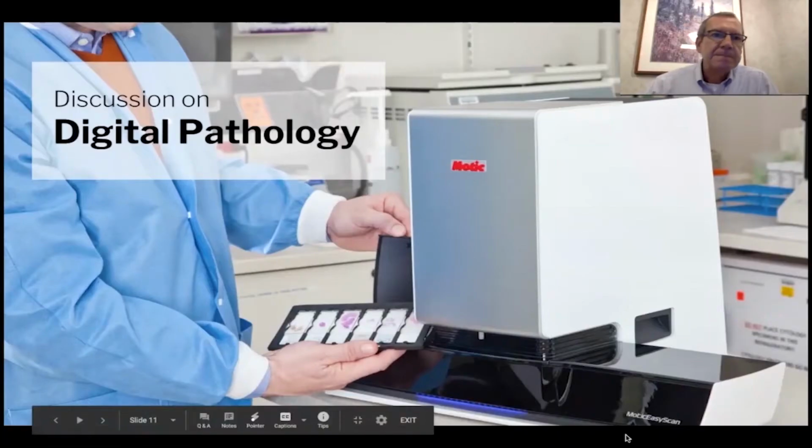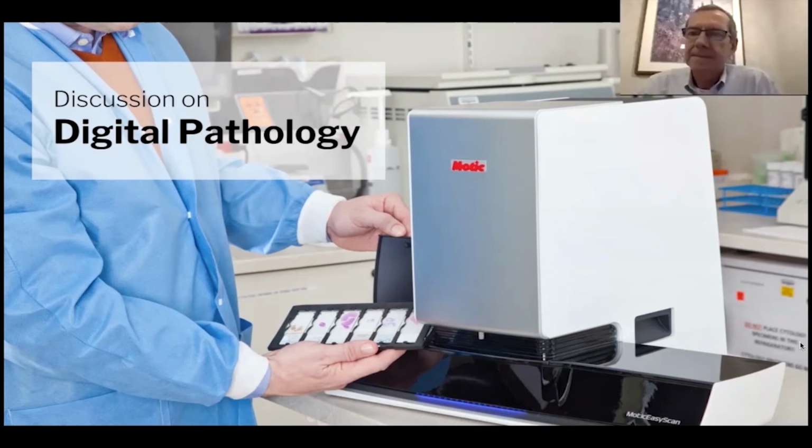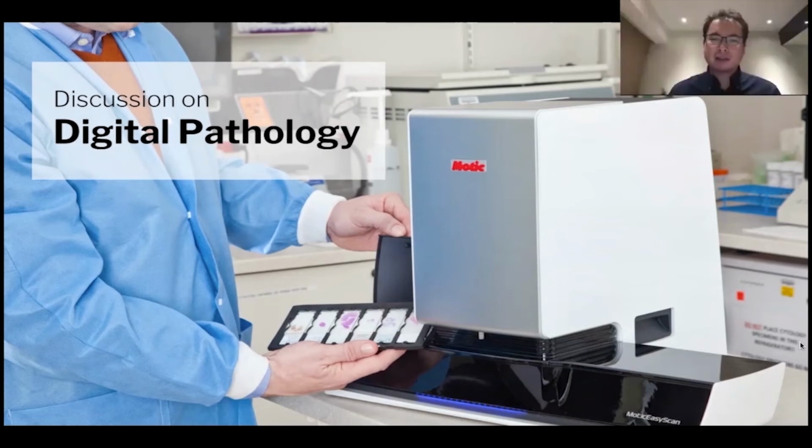Thank you very much for the introduction and case run-through, Dr. Solans. Thank you. So I'd like to turn to some discussion about the tool in general now and how it might be used or how it might be able to impact other institutions and hospitals. To begin with, having used it at your institution, how has it impacted your lab processes or benefited the patients?